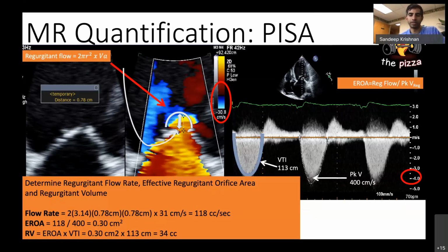So the lower the velocity here, the more it's like having a big open spigot or a hose with a really big opening. The water is not necessarily going to rush out of there, but a lot of volume can come out of there. It's just like if you put your finger over a garden hose, the smaller you make that hole, the higher the velocity of the water coming out of the end of the hose. Versus if you just take your finger off, you're going to get a lot more water coming out, but at a much lower velocity. That's probably the best way I can explain it. So does that make sense to everyone?